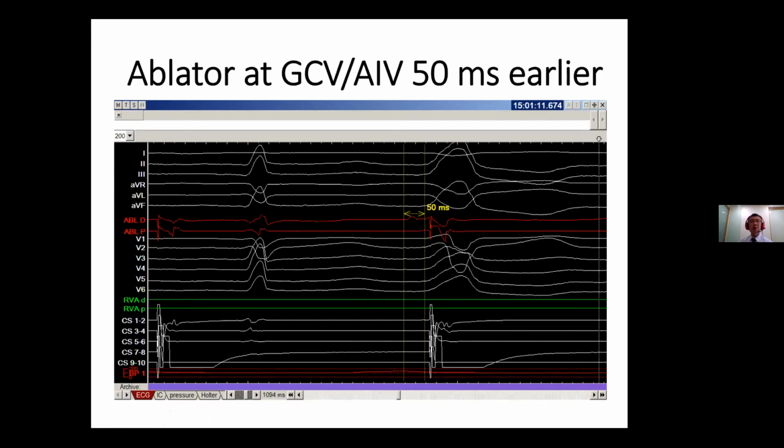And you can see why we paced from the CS, because it is very interesting for this case. When we do the CS pacing, the PVC will show up, but without pacing, only very limited PVC. I don't know whether that is because of the calcium load within the cell or not, but it is a very interesting case, because when we paced the CS, we did not intend to get the PVC, but the PVC appeared during pacing from the CS. So we kept consistently pacing from the CS to get the PVC.